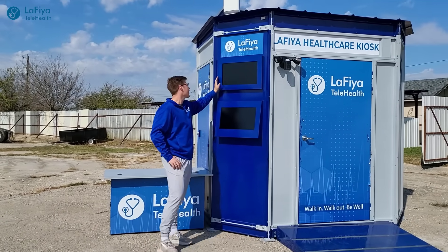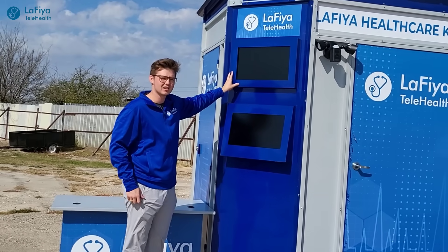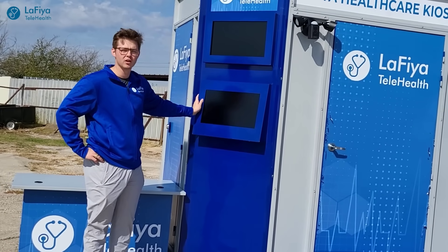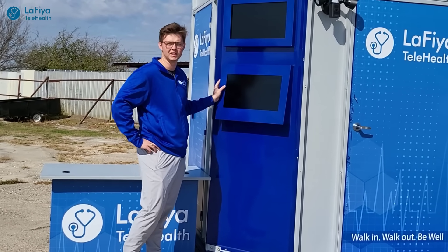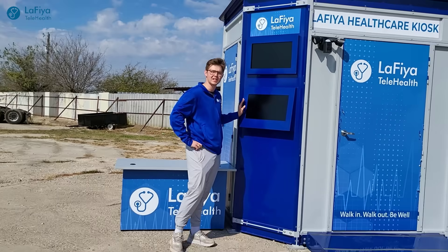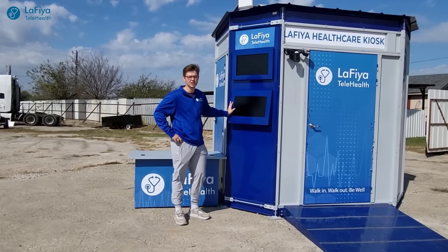We have a screen here to display all the things that this kiosk can do, from the outside to the inside. Next is our screen for patient check-in. This is where patients will come in, check in on this screen, and enter all their information so that they can then enter inside the kiosk for their medical visit with any type of doctor that they need.